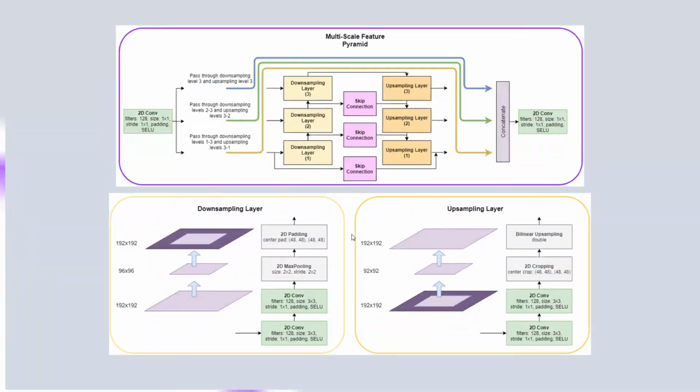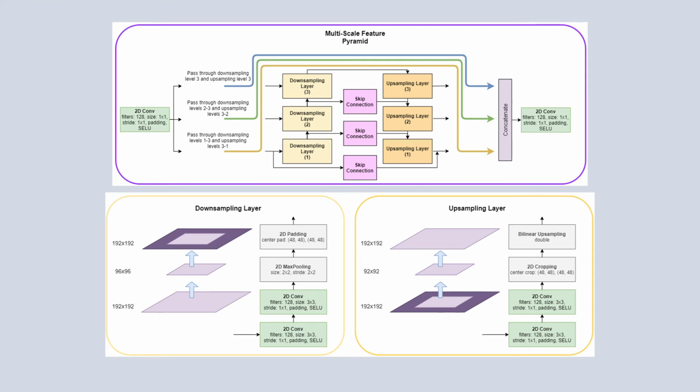Our proposed multi-scale input-output feature pyramid, that you can see in more detail here, is designed to share features between the short axis and long axis views, and also between slices of the short axis. We expect that it can also benefit segmenting cases with pathologies which the network was not trained on, such as dilated right ventricle. We do this by passing each input at different levels of the pyramid and obtaining the output at the respective output layer.